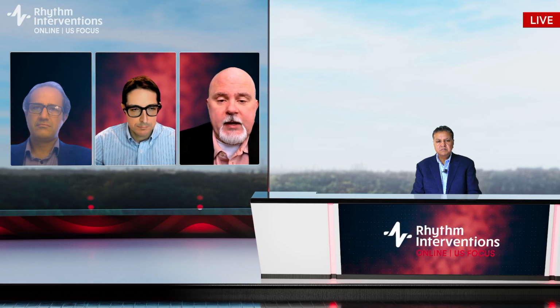I need to know pretty much where the flutter is, and then I can simply take out that area the size of a quarter and it's done. A little bit of almost a minimalistic approach. I'm sure guys like Sonny Jackman would blush at that. But half of our group is the opposite, and they'll say, no, I want to know exactly where that is, use RF, use a Qdot catheter, and get rid of it that way.